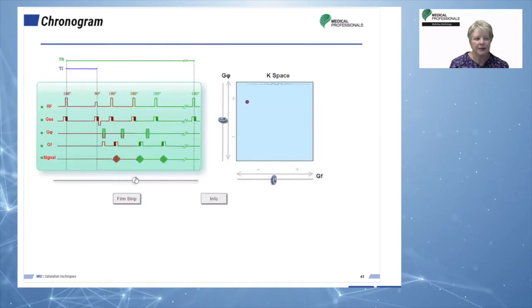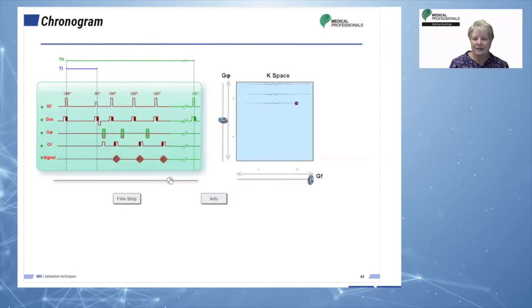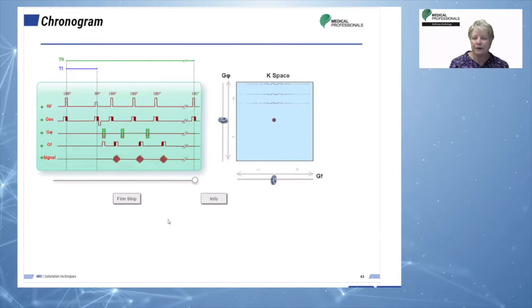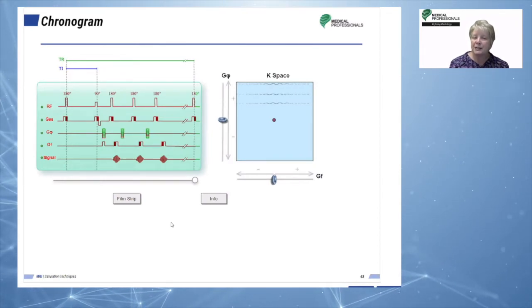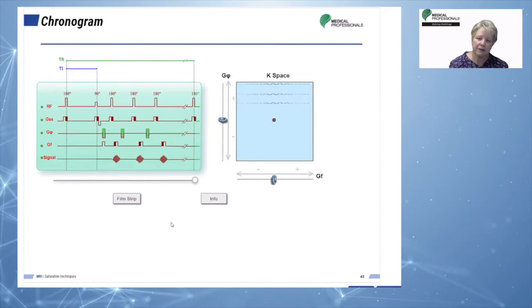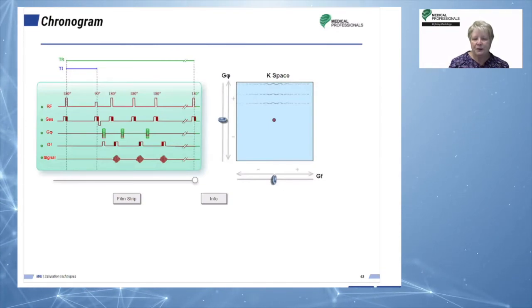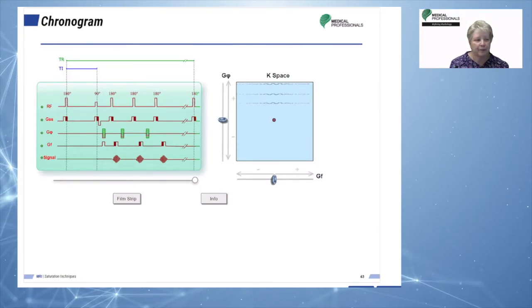Notice on the other side, we see K-space filling. So we see how much K-space is filled with each TR, okay? Therefore, acquisition times are much shorter as rows are filled at each TR. This is why this sequence is faster than spin echo inversion recovery. So the fluid attenuated inversion recovery versus just a straight inversion recovery sequence, okay? The number of rows of K-space filled at each TR is a parameter that can be set using the echo train or turbo factor. Okay.